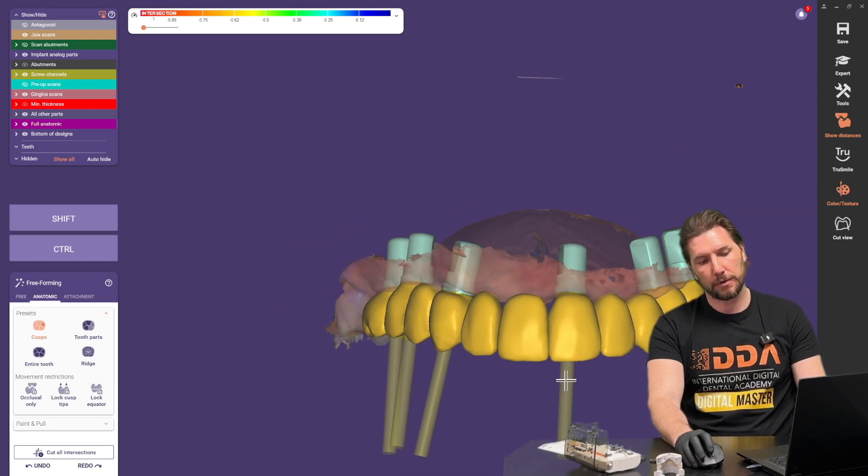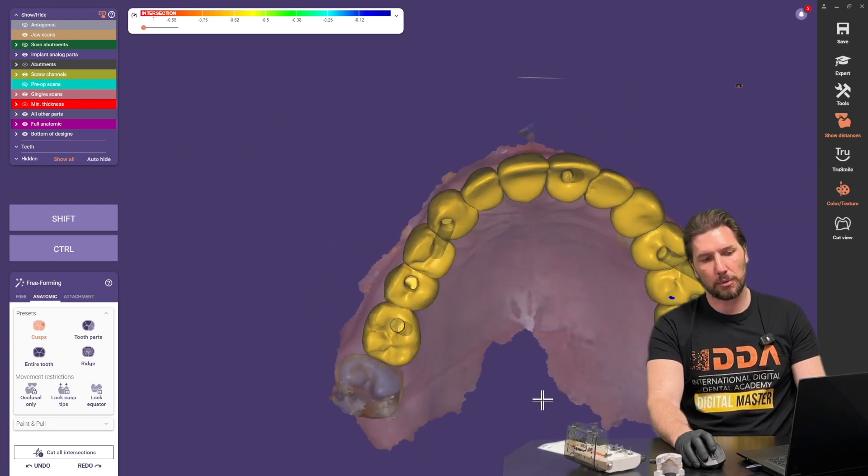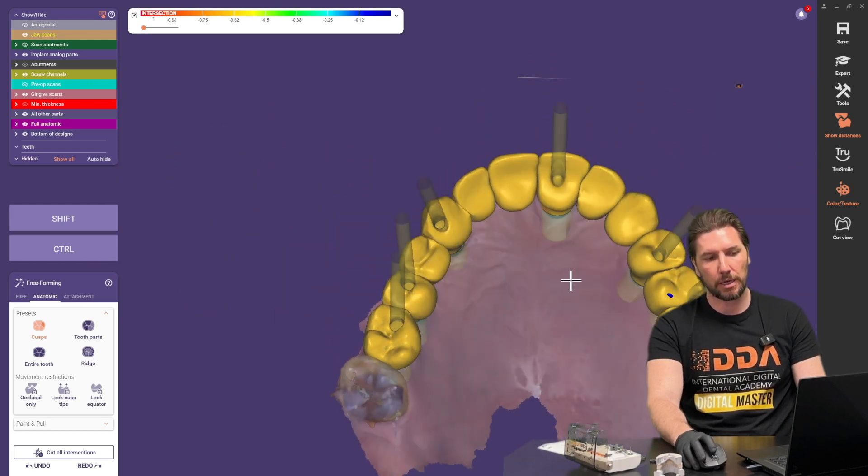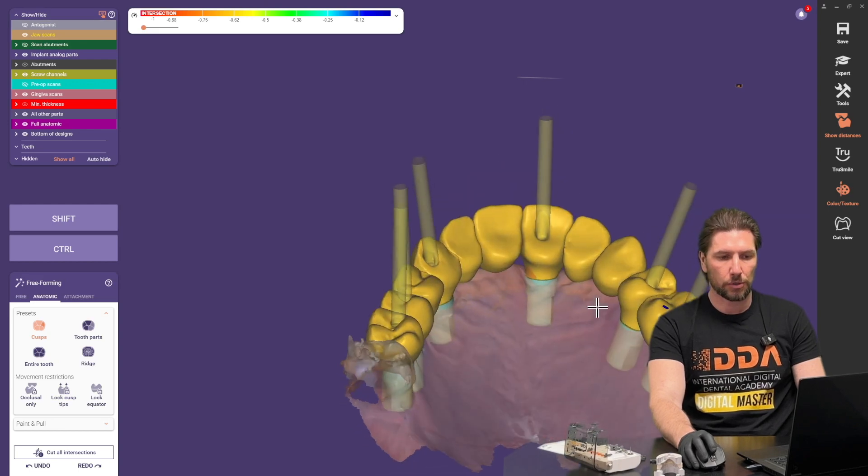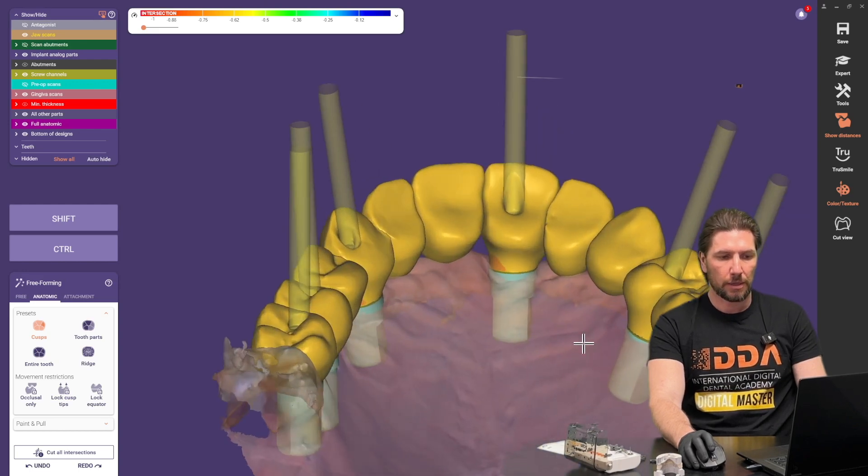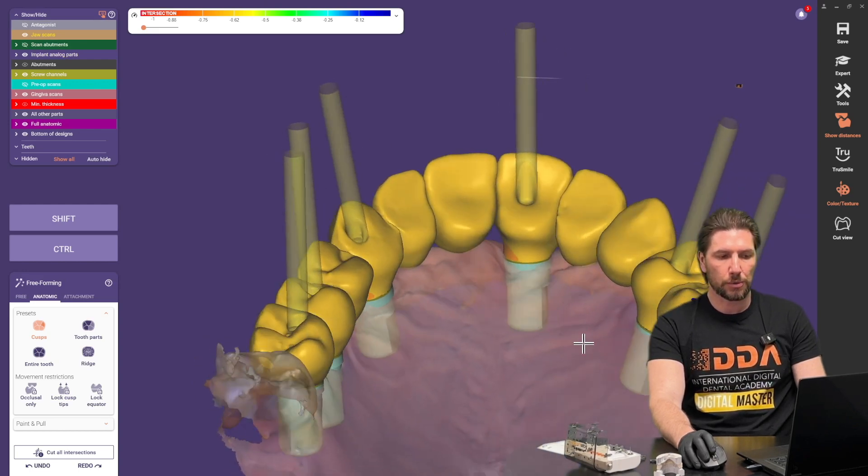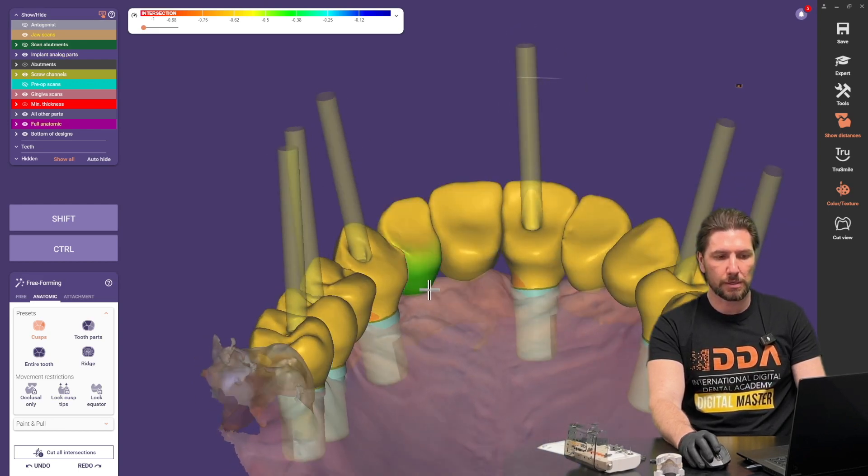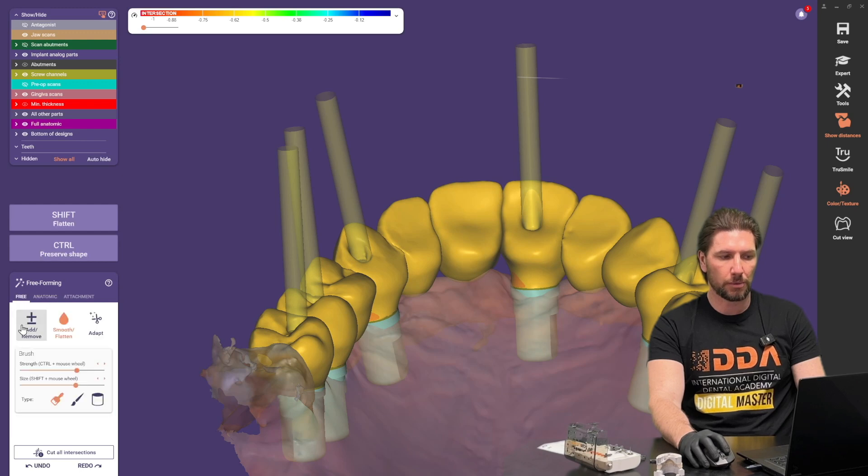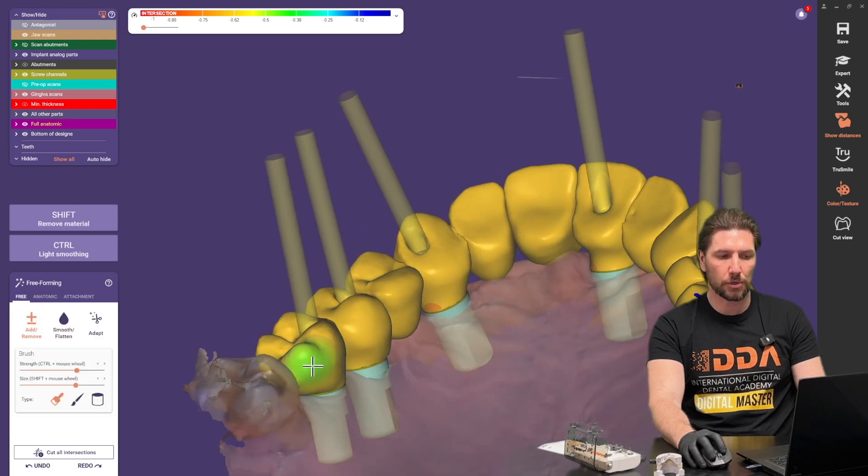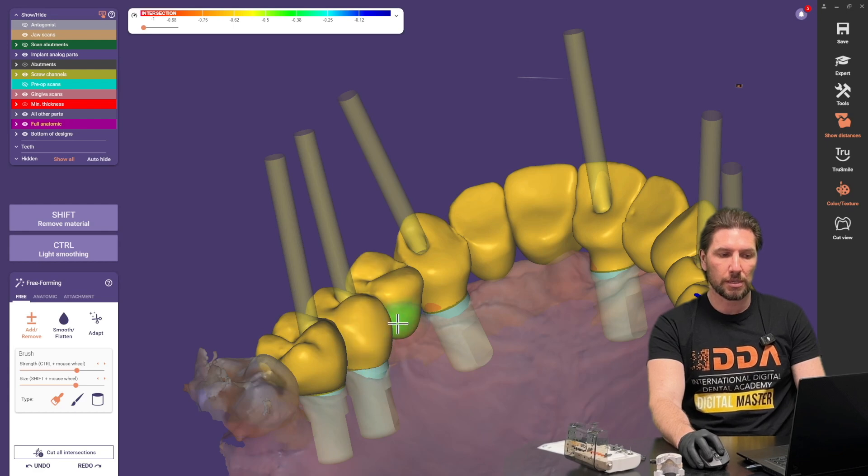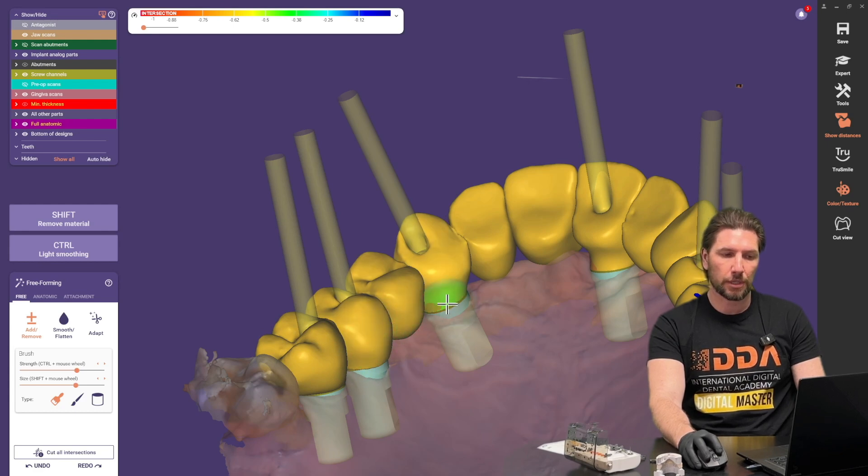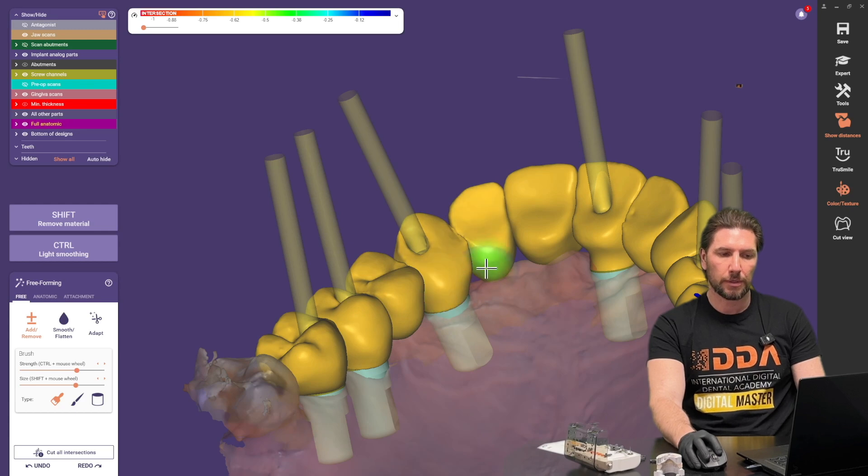The last thing we want to do is this interior portion so where the gum is we want to add a little bit of strength especially if we're going to be printing this because you need to have the thickness there that's going to give us the ability to print it and not worry about fractures or problems later on down the line.